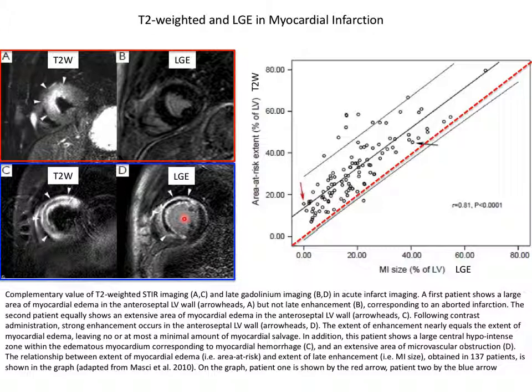In this patient, when you do the late gadolinium enhancement, you can see definitely there's dead tissue as a rim around this dark tissue here. And this dark tissue is truly dead tissue where the contrast agent doesn't even get in. Right? So the vessels are busted up and everything. This is called microvascular obstruction, and that's probably the worst state the tissue can be in.